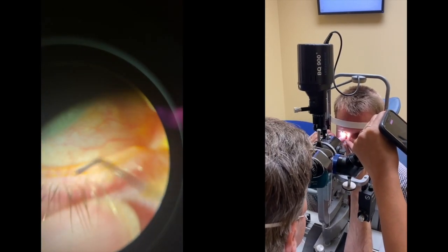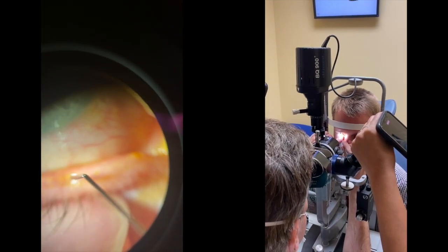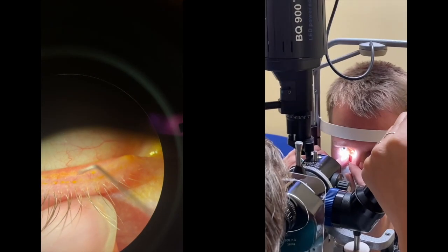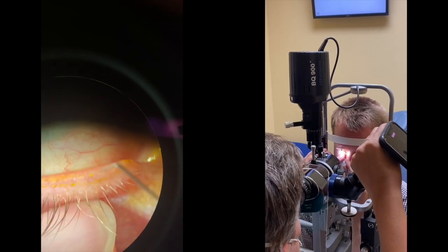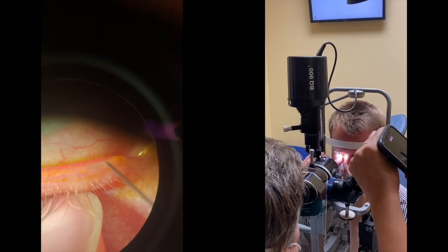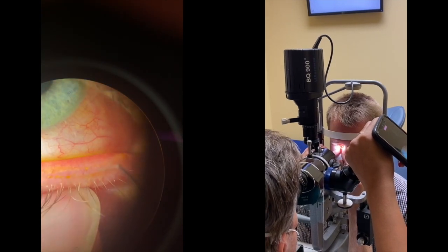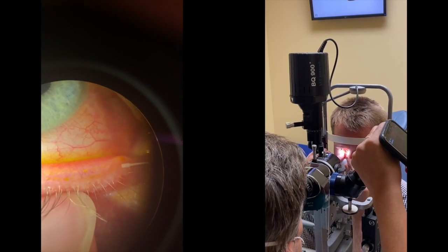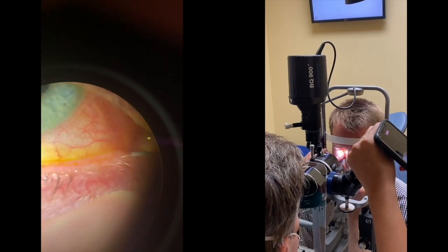Oftentimes if the meibomian glands are very inspissated it is difficult to use the probe, so I start with the shortest probe first, which usually allows a better opening of the meibomian gland, since the shorter the probe the more rigid the probe. After you've opened most of the glands you can move to a different length of probe to ensure you probe the glands as far into the lumen as possible.